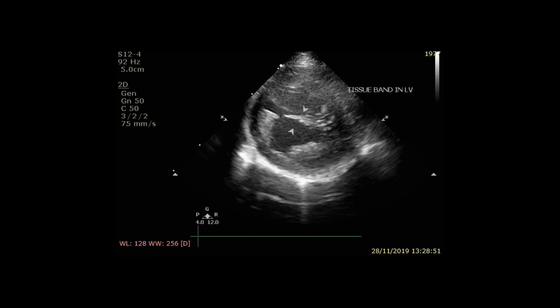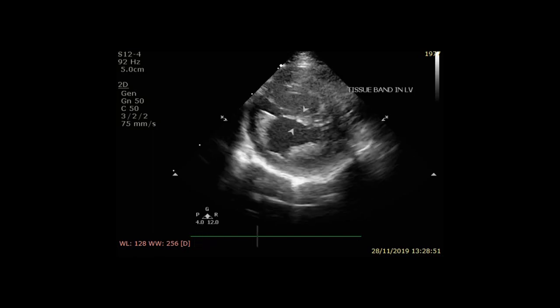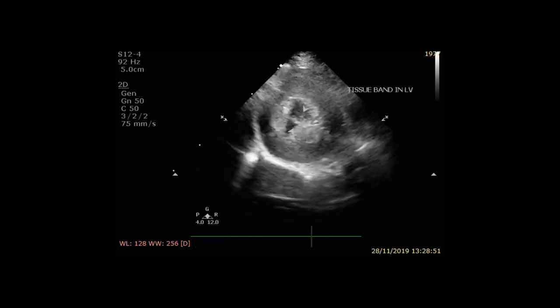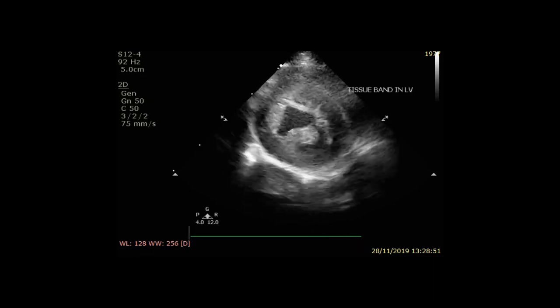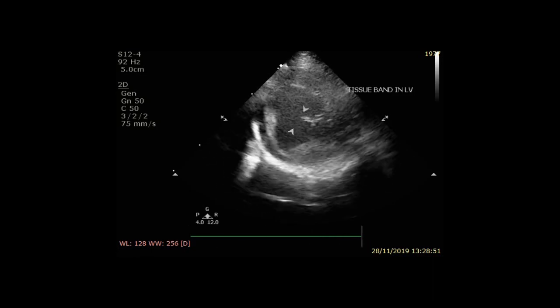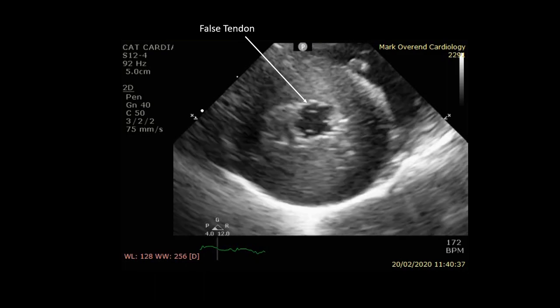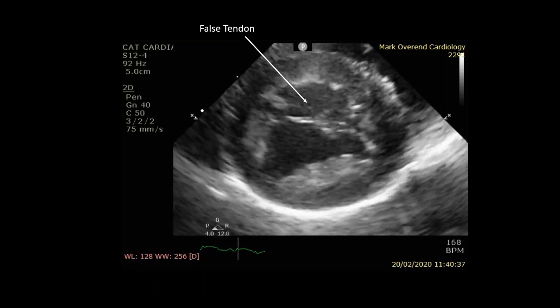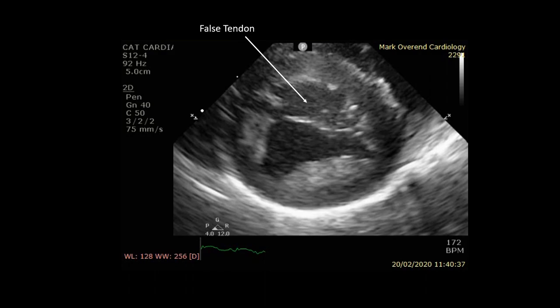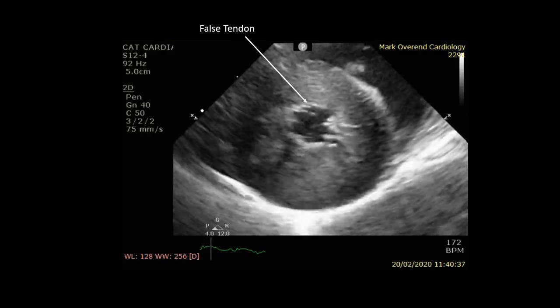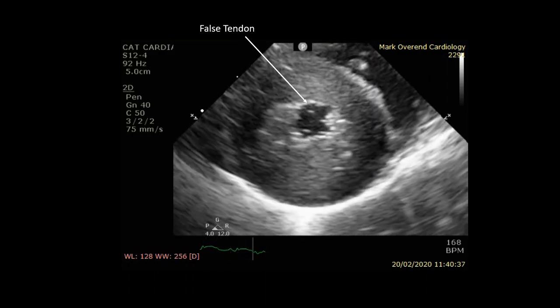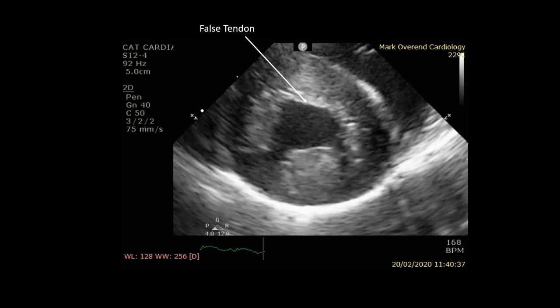Looking at the left ventricle on the short axis view, you can see a band of tissue or a false tendon crossing the left ventricle. Blown up, you can see the false tendon in the mid portion of the left ventricle at the level of the papillary muscles, which is what we commonly know as the mushroom view.